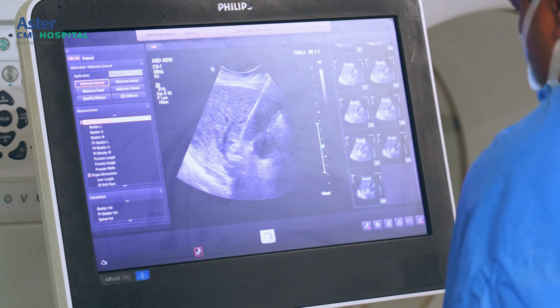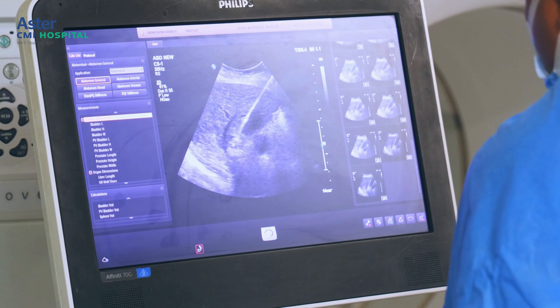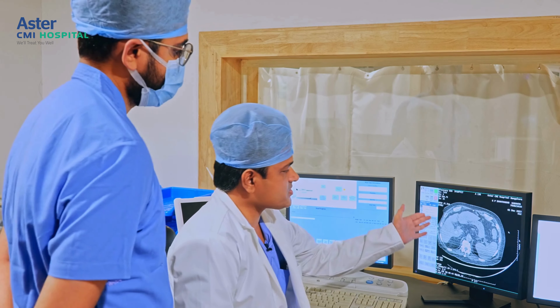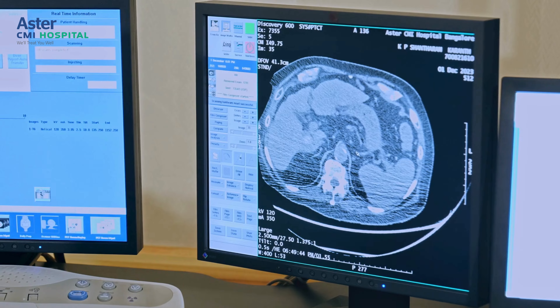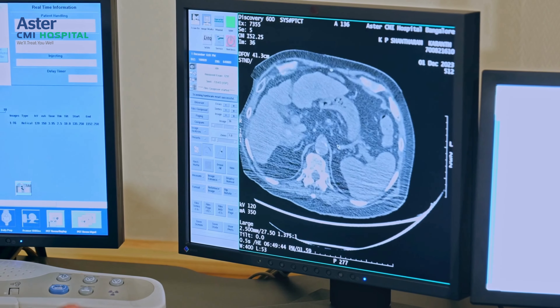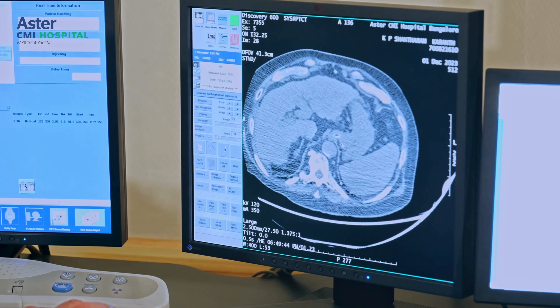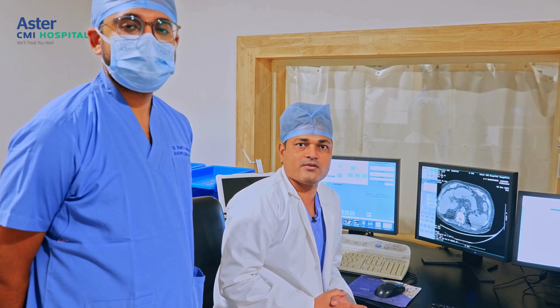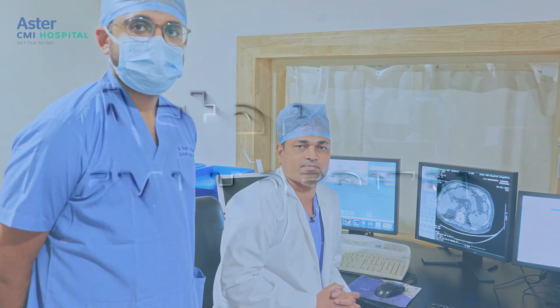We will be pulling out the needle at fixed time intervals — pulled by about a centimetre each time. We are going to do this along the entire length until the liver capsule. We have now completed the ablation. This is the post-ablation CT scan showing good ablation with a hyperdensity inside suggesting microbleeds. There is no extra-hepatic bleeding, active bleeding, or hematoma. Everything looks fine. With this, we complete our educational video on treatment of liver tumour in the caudate lobe with microwave ablation.